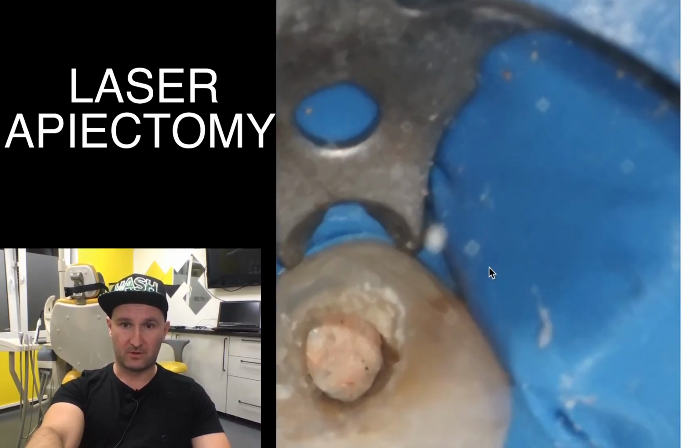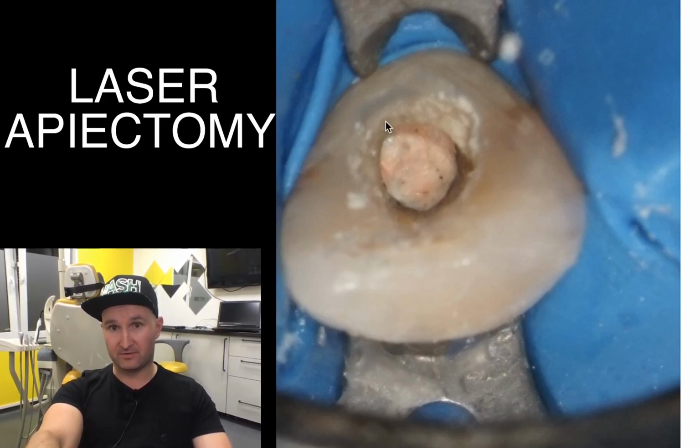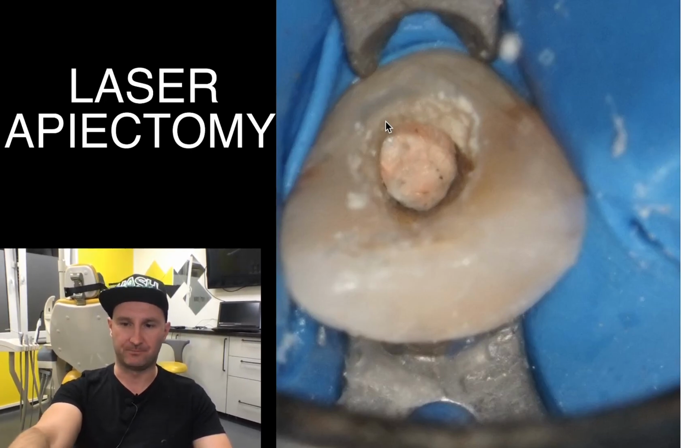Now it's done. So we filled and obturated the apex with Biodentine, and the rest of the canal we obturated with squirt of warm gutta percha and AH Plus sealer.